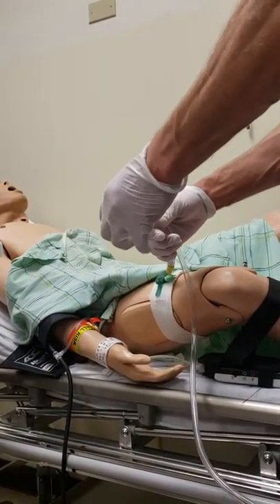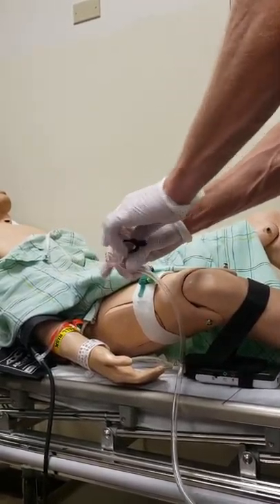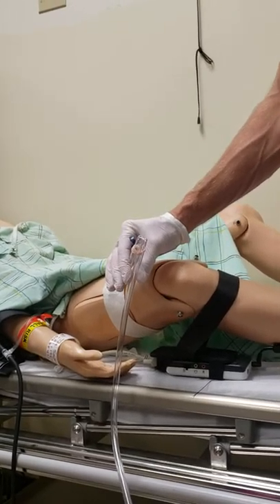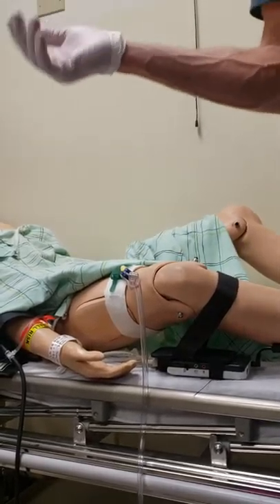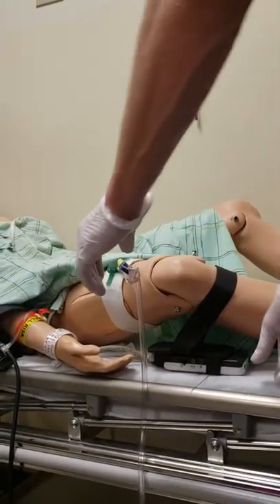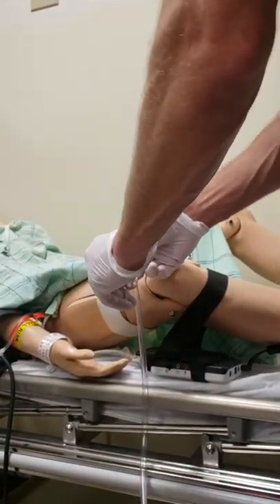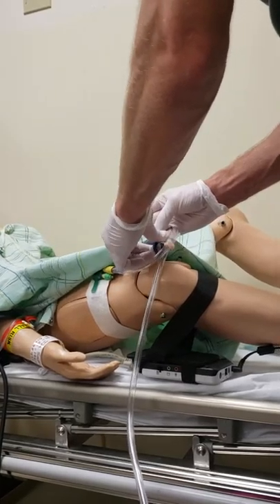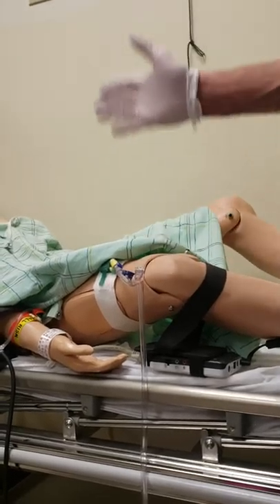I take it, and all I do is take the rubber band. I take off my gloves, wash my hands, tell the patient I'll be back in 15 minutes. That blue clip is the clip of the sheet so it doesn't pull when the bag pulls. That clip goes to the sheets like this. Some people use hemostats — I've found that hemostats pierce the tubing.